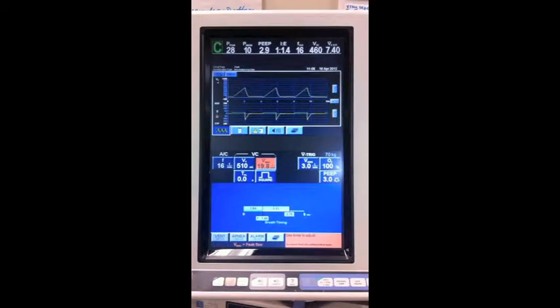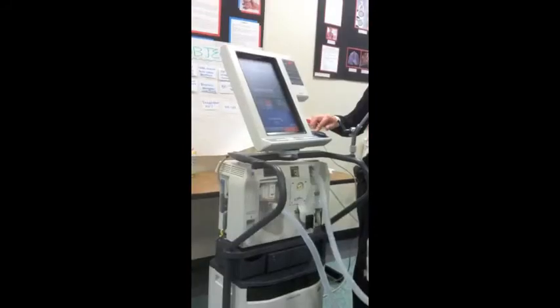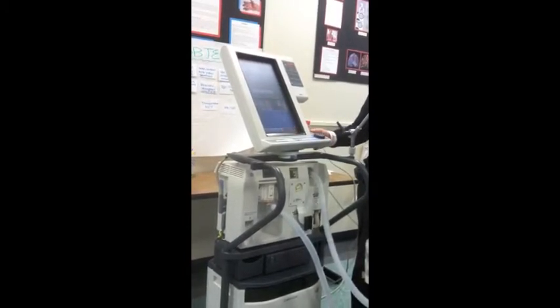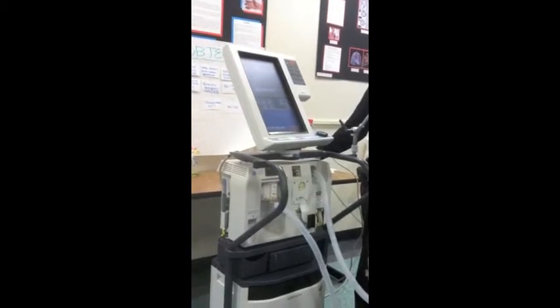You guys have to pay attention to this section because this is going to affect your patient's I to E ratio, which is very important. So knowing where the flow and the waveform needs to be, ramp, will change your I to E ratio. And usually a good starting point for flow is 60. So now we make those changes, and this will make everything happy again. It takes a few breaths to do it. See, now we have like a 1 to 3.